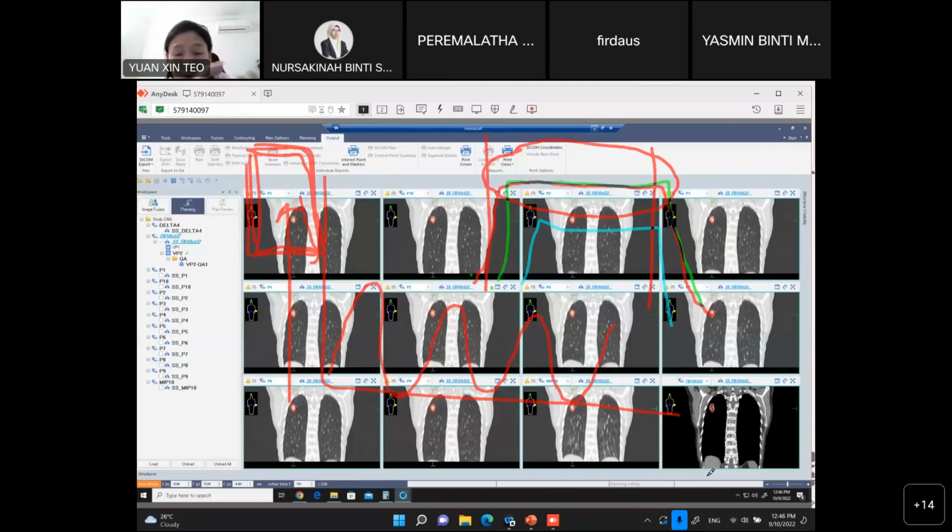There is also automatic and manual. Automatic means you tell the machine to automatically beam off when the tumor target is out of tolerance, or you do it manually, which means the radiographer beams on or pauses the treatment manually. So these patients will only start her treatment Tuesday.